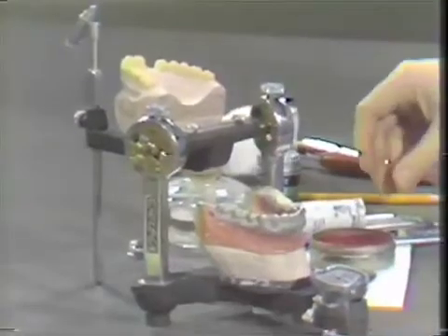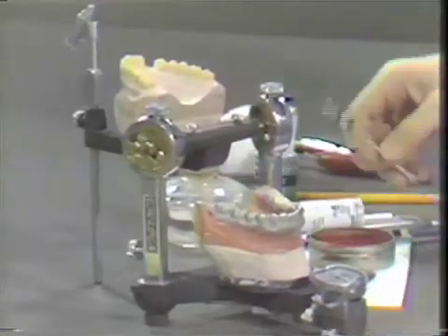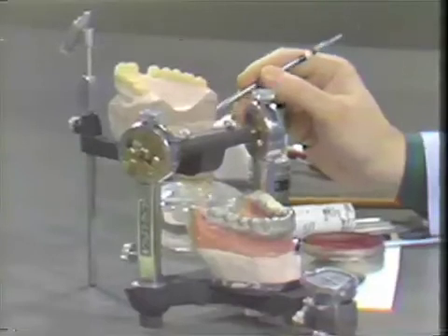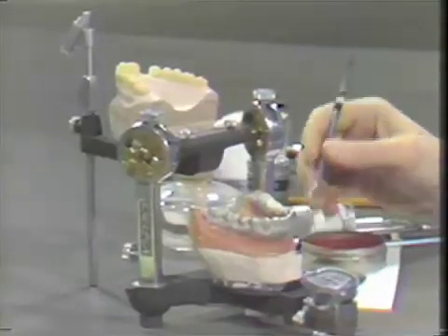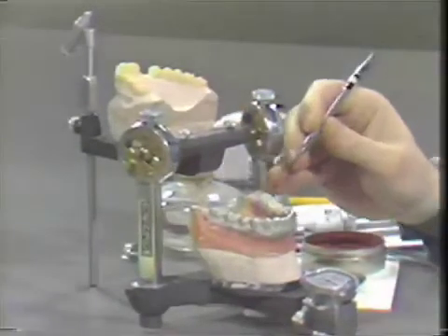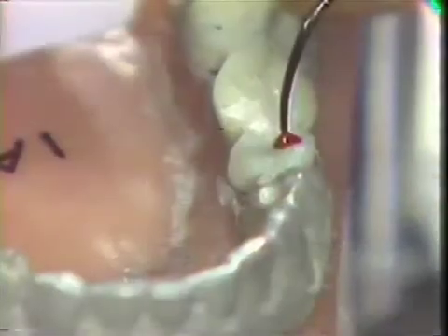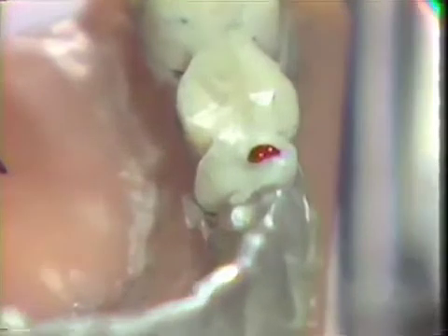We will be using the Peter K. Thomas waxing instruments, using the number 1 waxing instrument and red wax. We will begin to develop the centric supporting cusps of the mandibular teeth. These will articulate into the black dot areas on the maxillary cast.